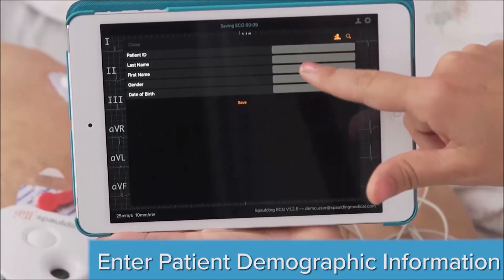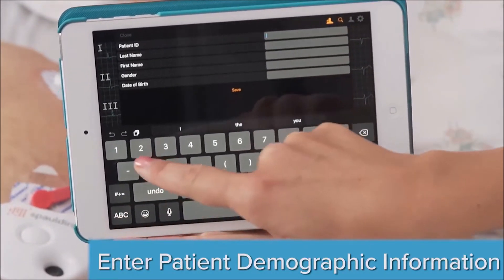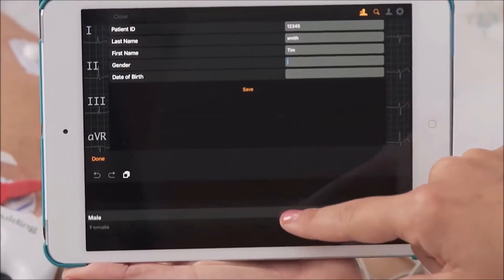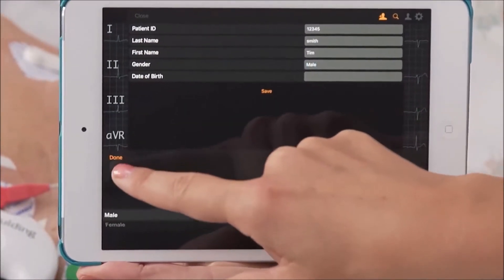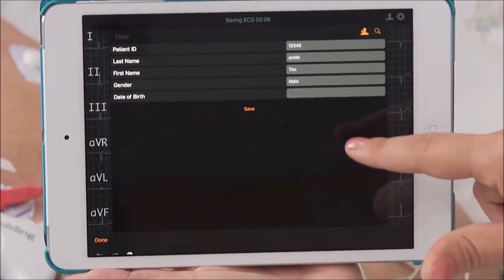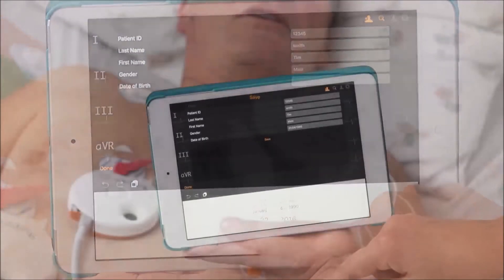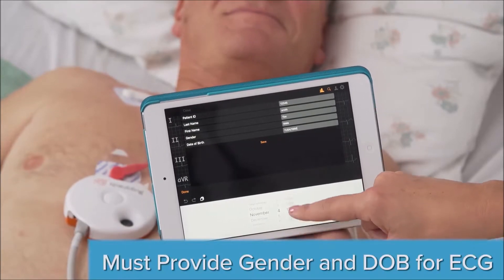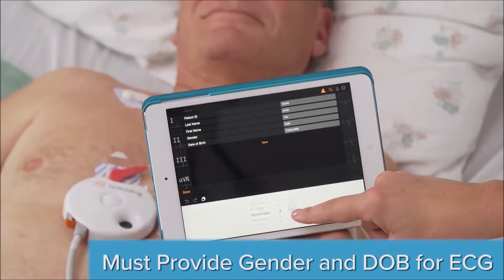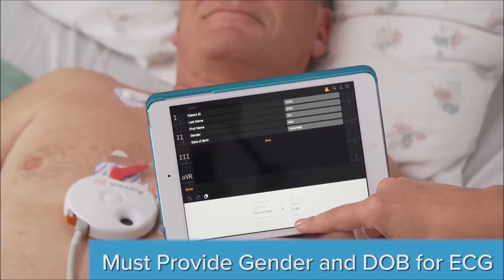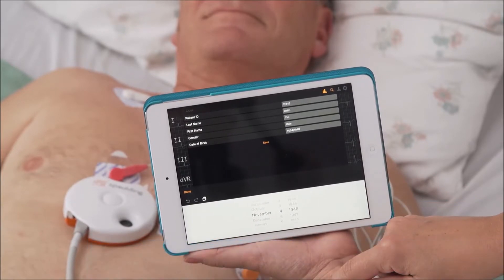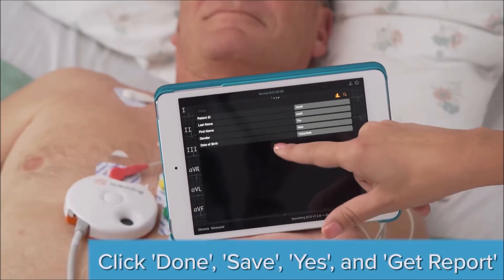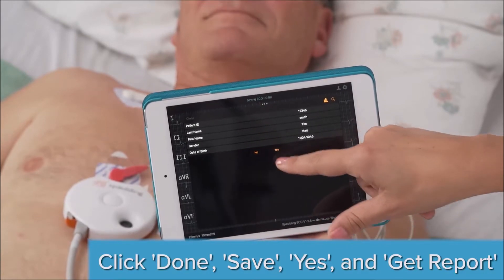Once you view the ECG, you will be prompted to enter the patient demographic information. This information will either be populated ahead of time with the web ECG software, or you can simply enter it when you are with the patient. The demographic information is customizable, but at a minimum, you will need to record gender and date of birth in order for the algorithm to provide an analysis on the ECG. Make sure to select Done to complete the demographic entry, then click Save, then Yes.